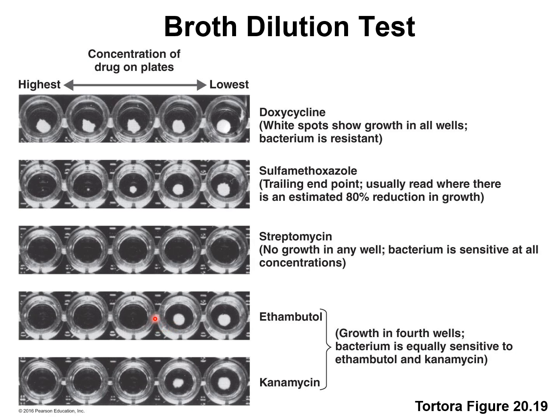If we look here, the MIC levels would be somewhere here on the medium concentration range. And depending on what those levels are, if you can reach above the MIC level in the body, then sure, they would be fine to choose to use and they would treat the infection. But if you can't get above those MIC levels, then you don't want to use those. They won't treat the infection. Okay, so the bacteria would be resistant to those.